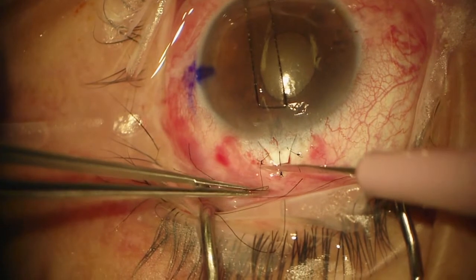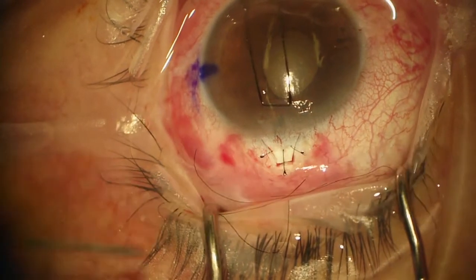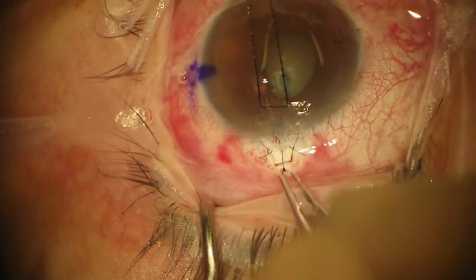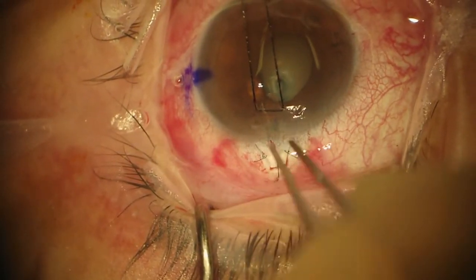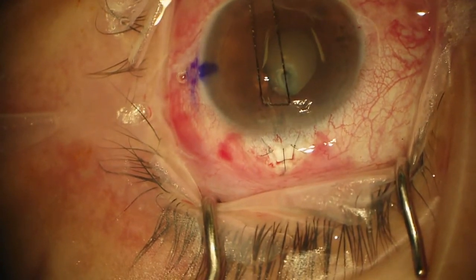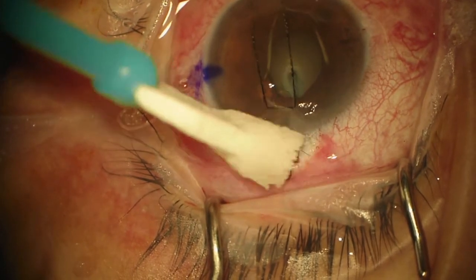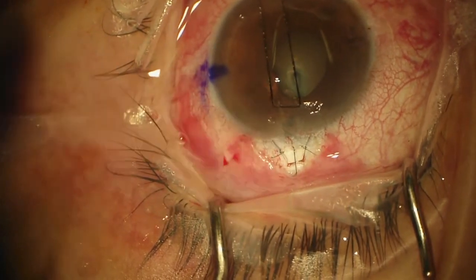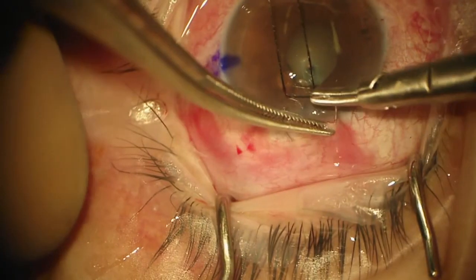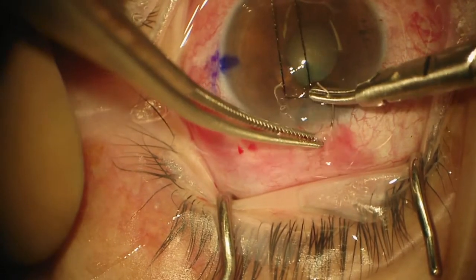You can see if they'll bury — sometimes they do. I use a very fine needle so they don't always bury. Before we close, we'll double check the eye: chamber's good, pressure's good. I make a nice big bite.